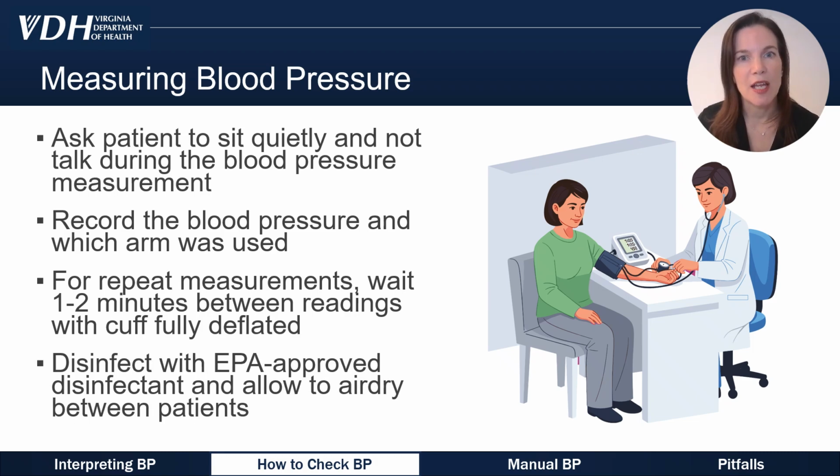And then after you're done, you want to wipe down the cuff and any other parts of the device that might have touched the patient with an EPA-approved disinfectant and allow the device to air dry before using it for another patient.